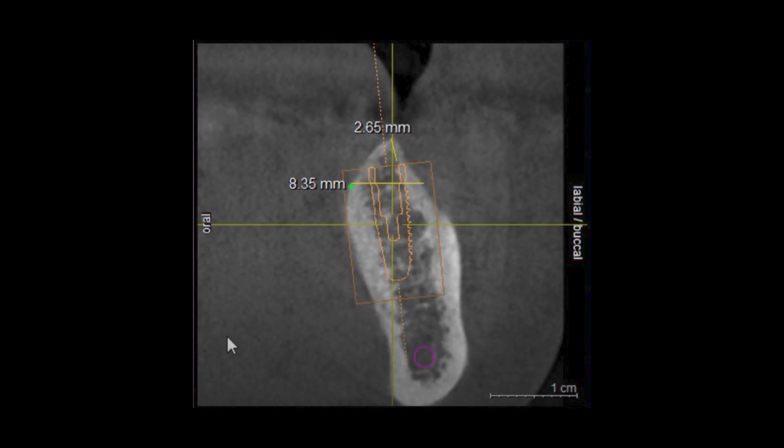This is an example of what I was talking about — the ridge shape. At the very top of the ridge there's a little triangle, and that can make it hard to choose your initial prep site. This is just an example x-ray, not the x-ray for the following patient, but I'd like to show you how I typically manage this type of ridge.